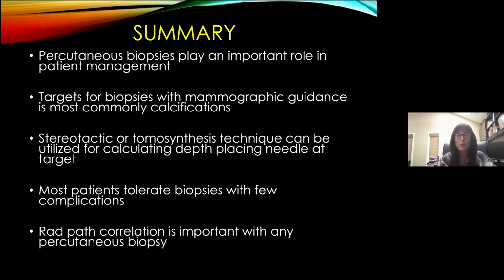Targeting can be performed either with stereotactic imaging or tomosynthesis, the latter being most commonly used at our institution, but both work very well. Most patients tolerate these biopsies with few complications and with challenging targets. With a few modifications, we are usually successful in biopsying the area. And finally, RAD-path correlation is important with any percutaneous biopsy, and this is the responsibility, or should be the responsibility, of the radiologist performing the procedure.